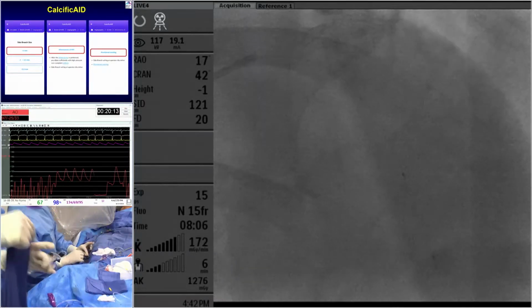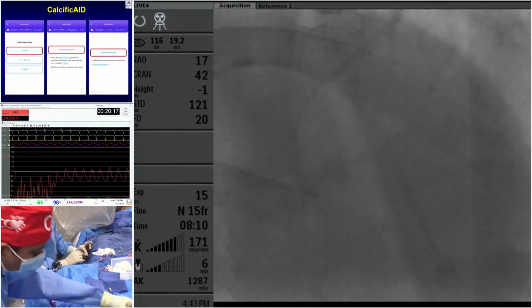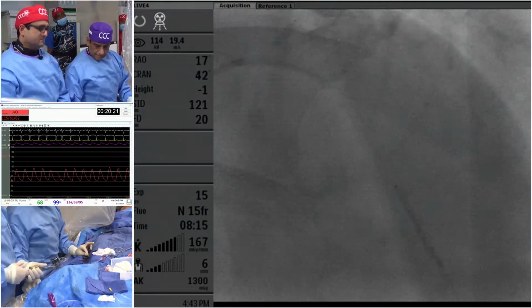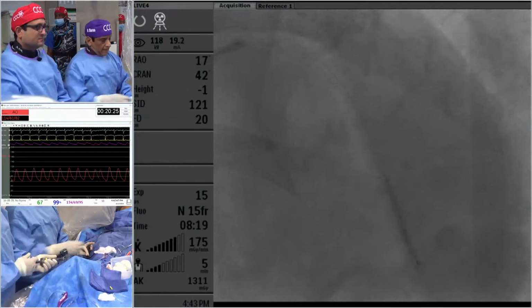It doesn't look to be obstructive, so the question is if stenting will change events there. And that can improve also the vasoreactivity of the vessel downstream if you have a stenosis proximal.